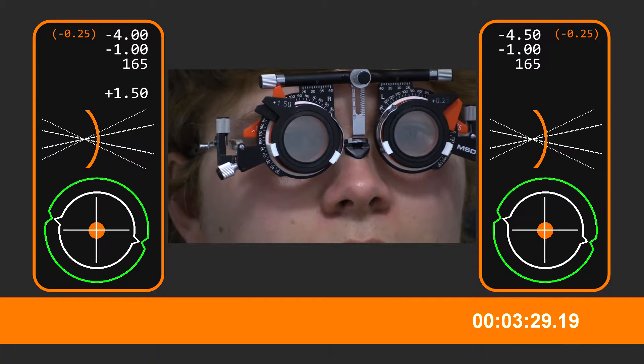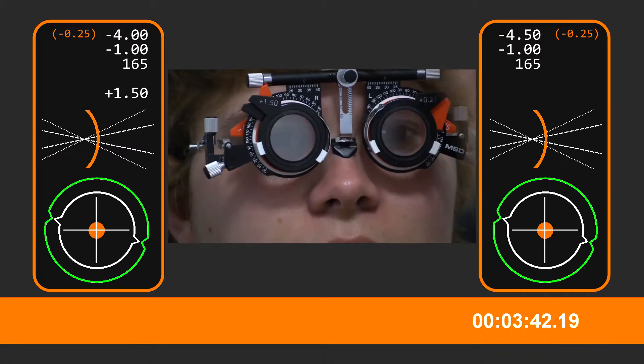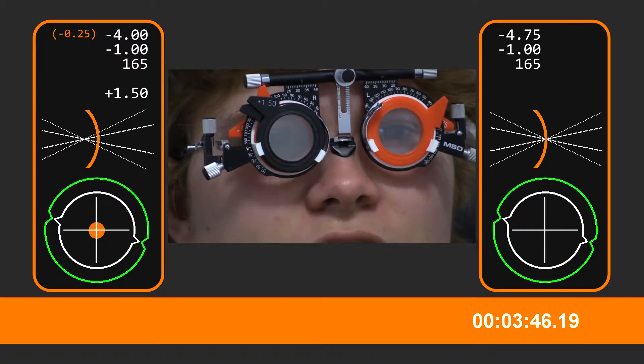Have a look at the letters there. Can you see any of those ones? Top line here — A, G, F, T, M. Better with this one or better without it? Without, actually, yeah.